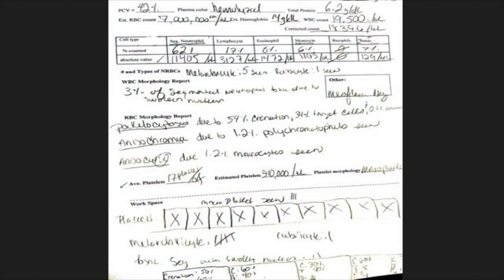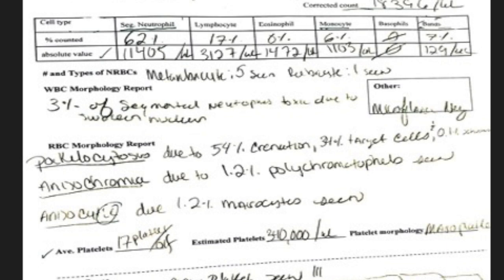Here is a quick glimpse at what a typical differential report looks like. In the report we also have to evaluate the platelets and many other things. This report is basically how we show our findings. We use the data that we find here to diagnose our patient. For example, if an animal has a higher white blood cell count than normal, that may lead us to believe the animal has an infection, since white blood cells are multiplying and those are the main cells that fight off infections.